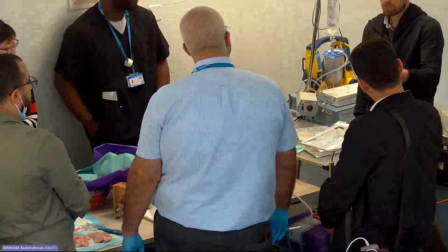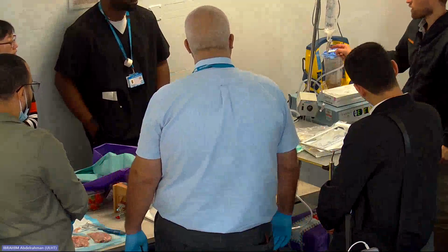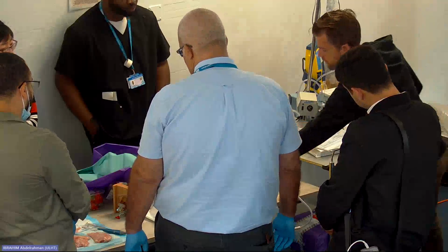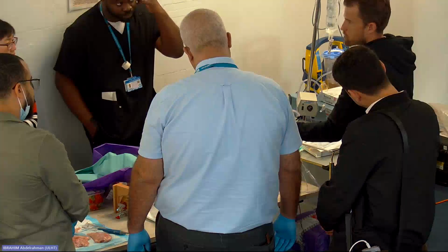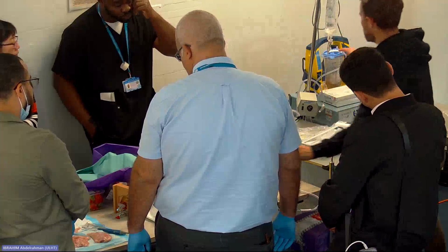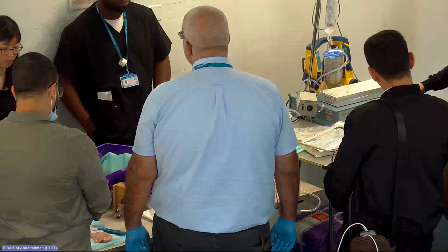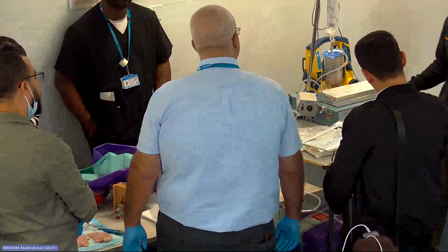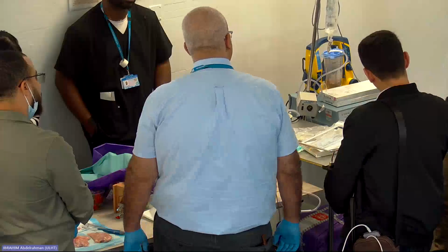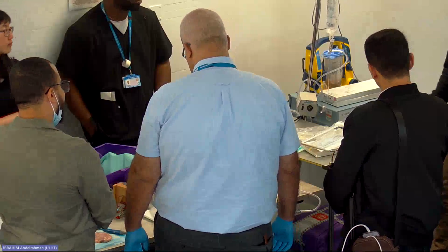Don't look at the tip and try to guess how much saline, because it depends how you hold it. Always look up. When it comes to surgery, you're going to be holding it very much like that. Drip just as you want to, but use this as your gauge, not the tip. That's it in terms of setup. So that's really important: the irrigation balance, and this box. Remember those two things, then you're set up and good to go, and I'll hand over to you.